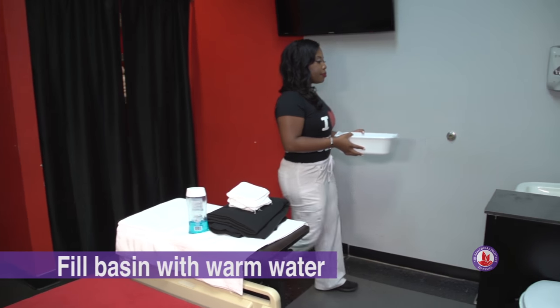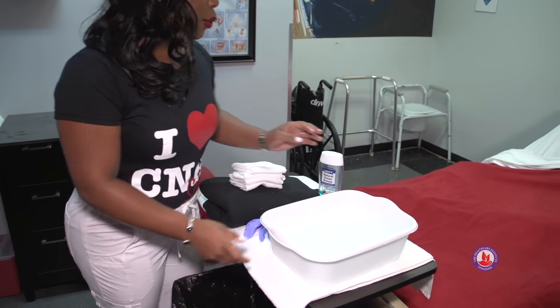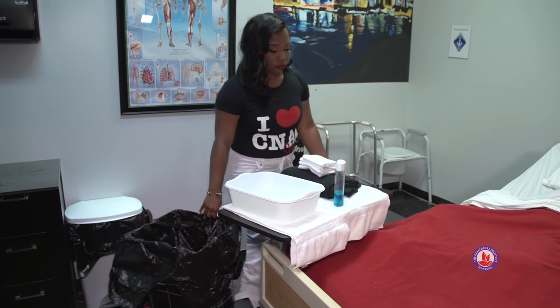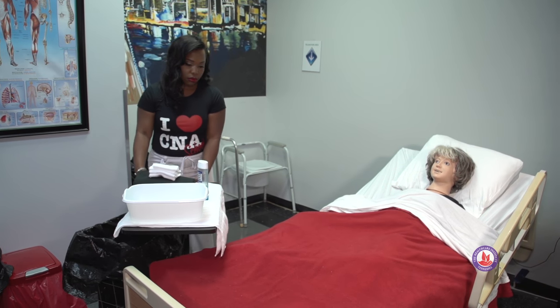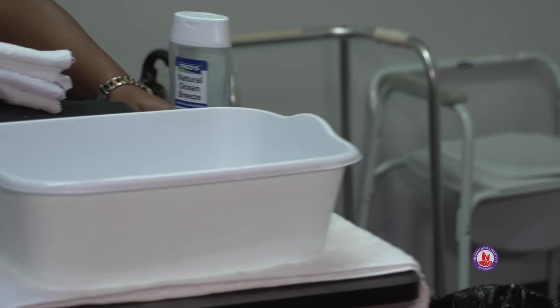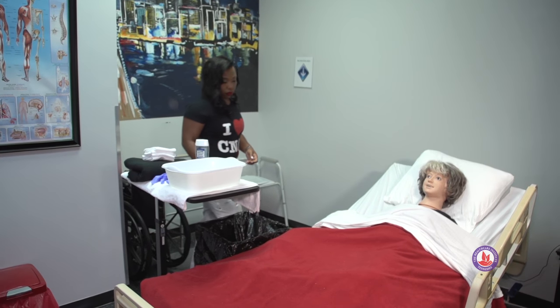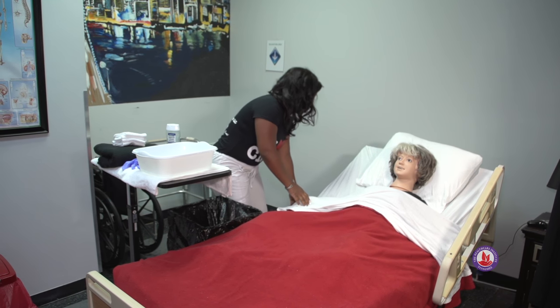Now I'm going to fill my basin with warm water. I'm going to place this on our bedside table and move to our working side of the bed. You also want to take your hamper with you. We're moving our bedside table to where we're going to be working so we don't have to go too far for our resident. Now we want to make sure that we're working at a comfortable level, so we need to raise the bed to work in height.